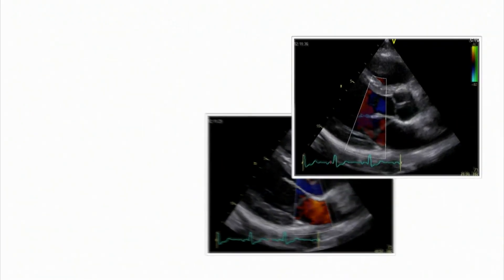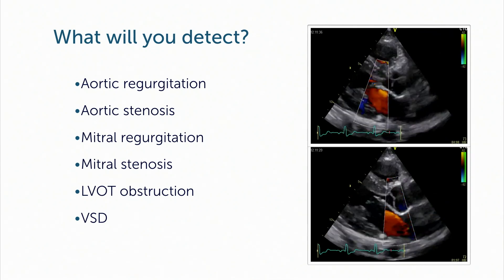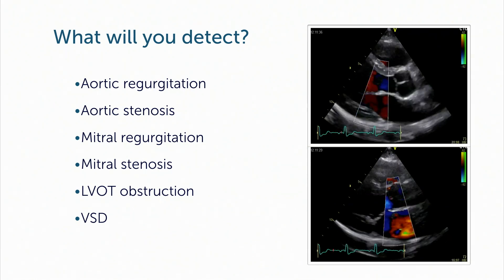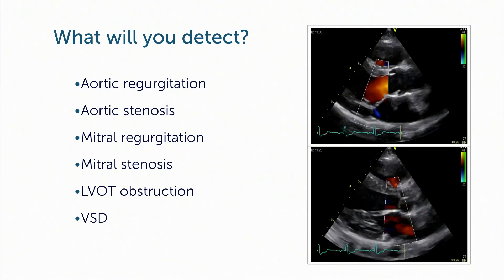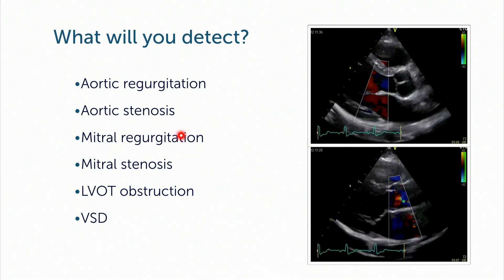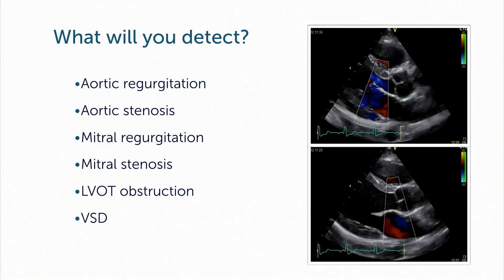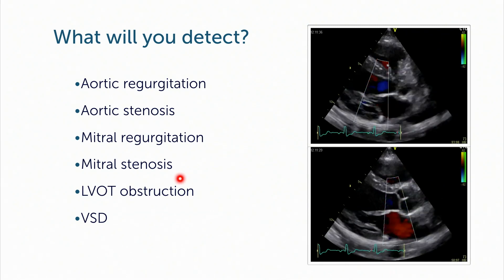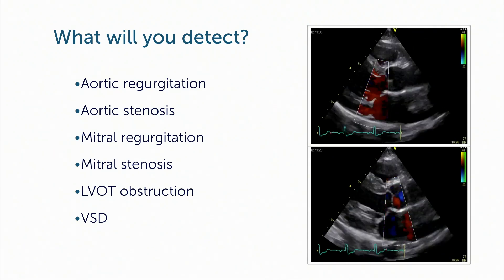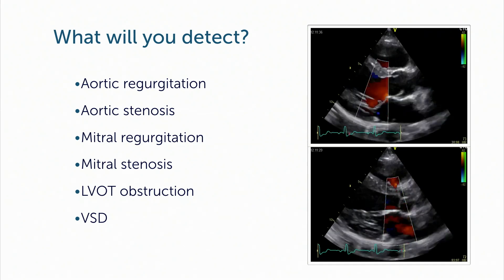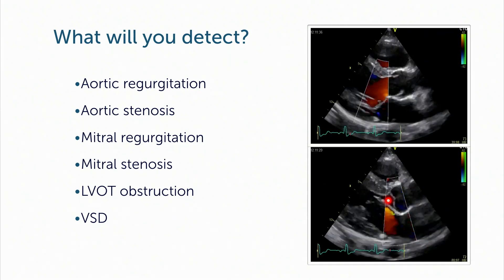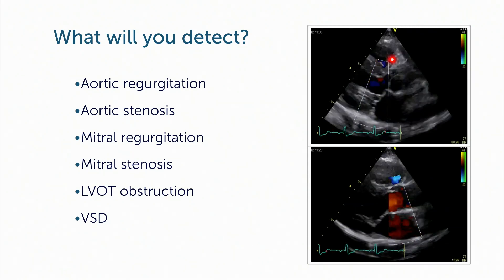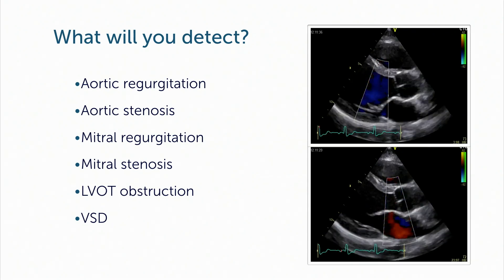Here's where else we can use color Doppler in the parasternal long axis view: aortic regurgitation, aortic stenosis where you'll see turbulent flow or flow acceleration at the aortic valve, mitral regurgitation as seen in this case, and mitral stenosis where you'll see turbulent inflow into the left ventricle. It's also a perfect view for LVOT obstruction, letting you determine whether flow acceleration occurs at the valve or below it. Finally, you can also detect a ventricular septal defect, though this is probably not the ideal view for visualizing a VSD.